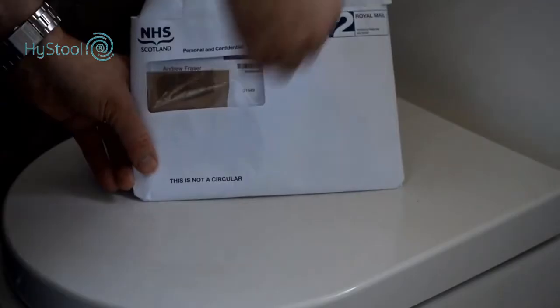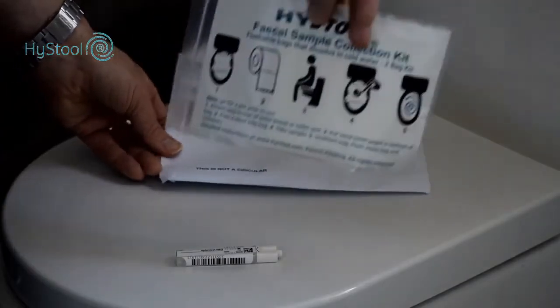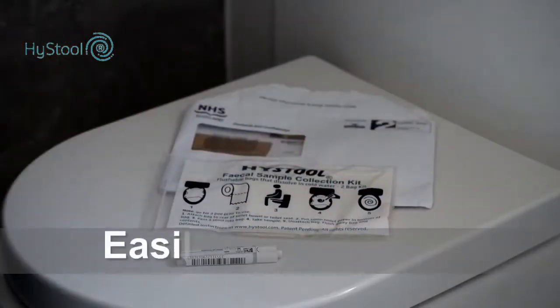High Stool is the simple way of carrying out a stool sample screening test. It easily fits inside the test kit envelope. High Stool is as hygienic as possible.